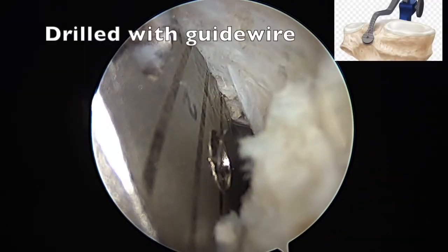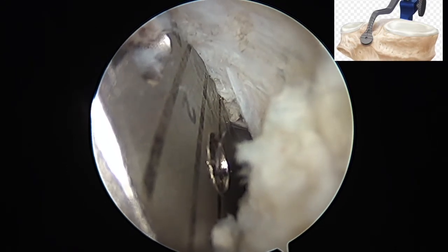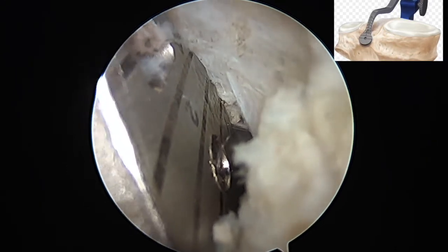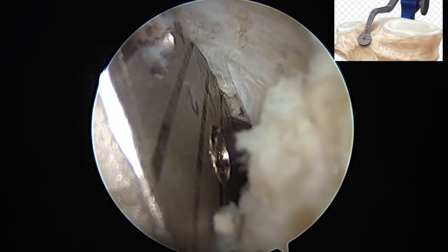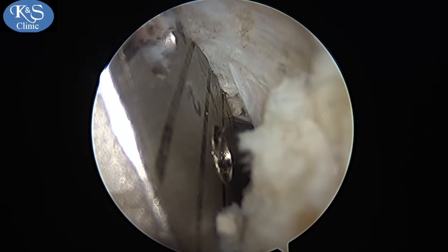Care is taken to spend time on the jig location as this improves isometricity. It is then drilled with a guide wire, and this jig has a trap that traps the guide wire, as this area has vessels behind it — it is imperative to be careful.